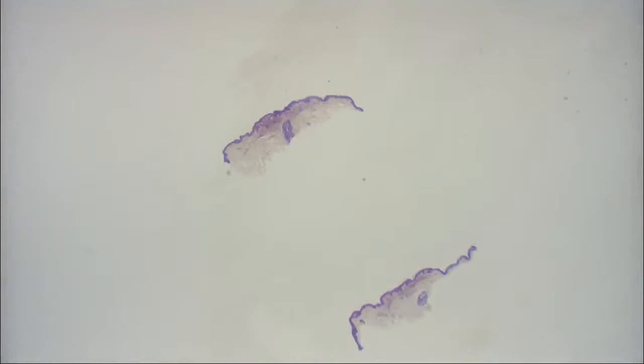So that's what it might have looked like clinically. They're often kind of bluish, so they're often thought to be maybe blue nevi, things like that. And then you can see what it looks like. They didn't enucleate that; they actually excised that one on the right. But sometimes you'll just nick over this thing and it pops right out. Okay.